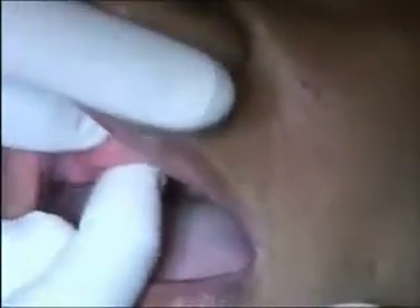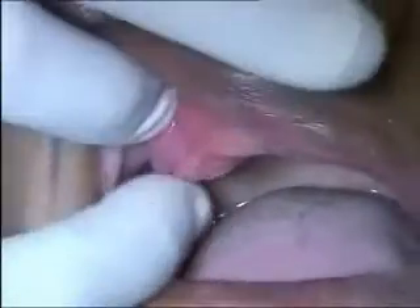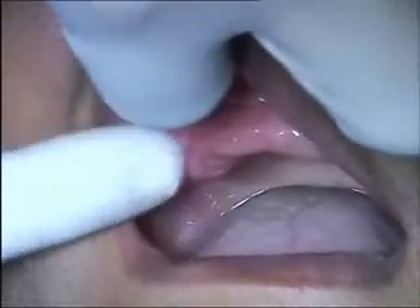Flabby, very very flabby. That doesn't mean that there is a fantastic amount of bone available. We have been quite surprised because the patient had a lot of periodontal involvement for a long time, and when the total extraction was done, the flange of the denture was hurting into the soft tissue. There are folds and folds of this soft tissue here — a flabby, soft ridge.